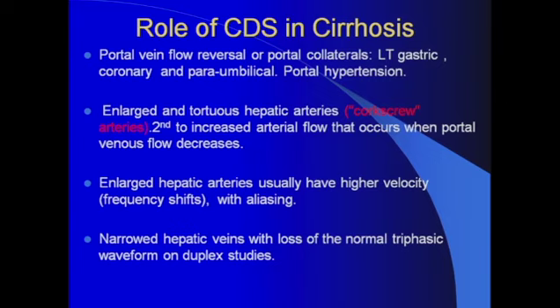And this is quite a common thing in advanced liver disease and cirrhotic patients, where due to fibrosis, the fibrotic tissue on both sides of the vein can compress the veins and create a focal area of stenotic segment, reflected as abnormal aliasing velocities. In addition, spectral Doppler evaluation of these hepatic veins will help you supplement your findings, either increased velocities or loss of the normal triphasic waveform. We talked about it earlier in the evaluation of fatty liver.